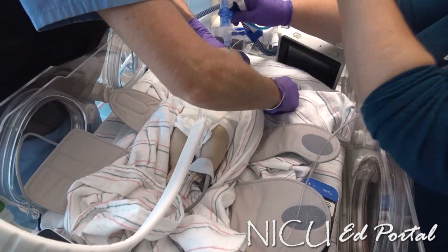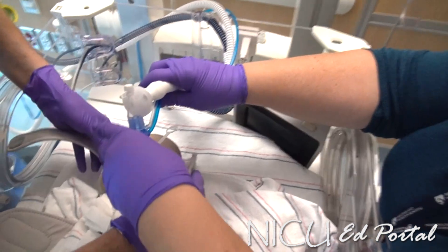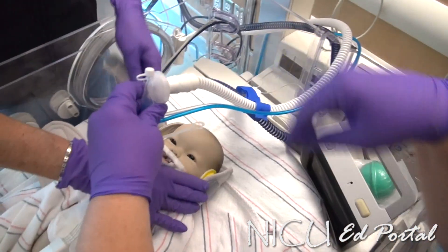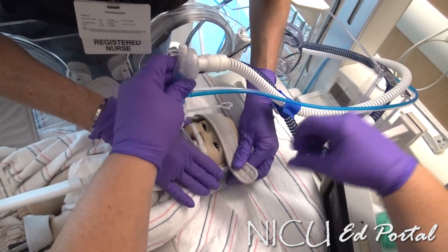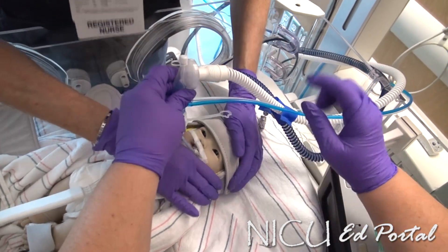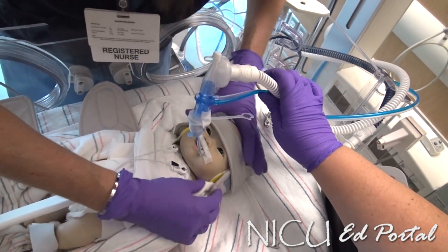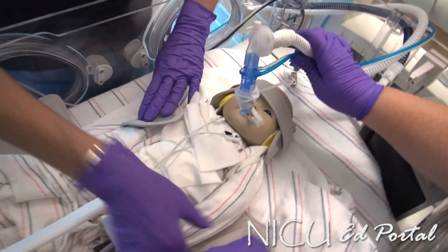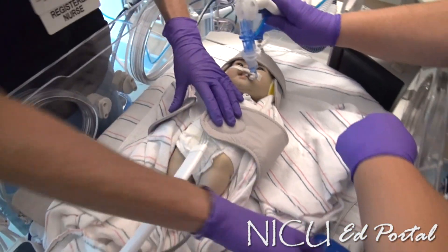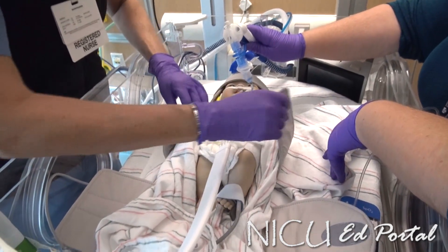We're nearly ready to go. Starting from head downwards, we get him swaddled up. I don't want to cover his eyes of course — there he is at the very top of the swaddle. That looks pretty good. His ears are nice and protected.